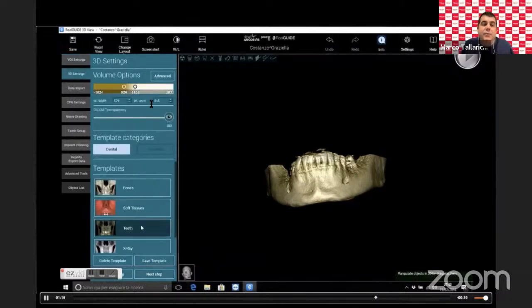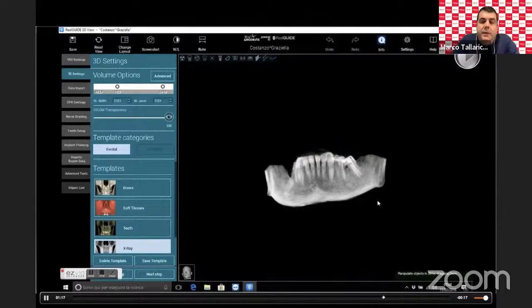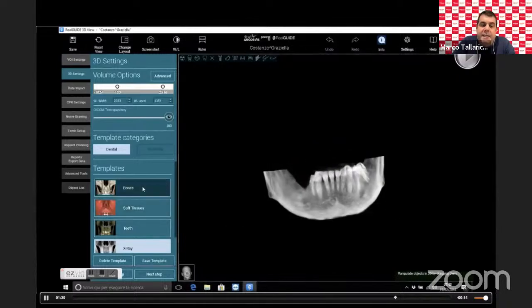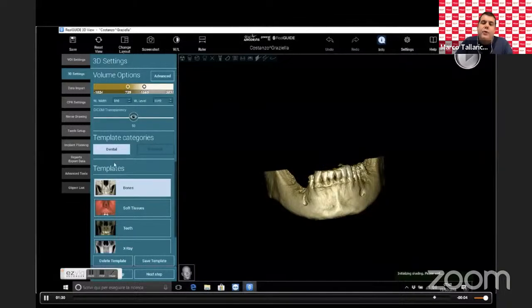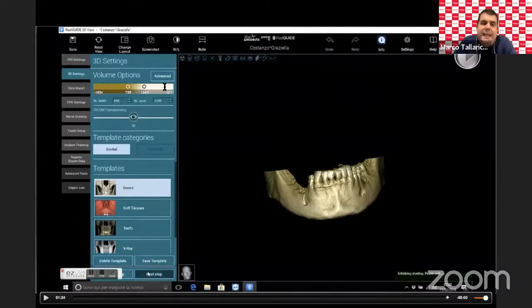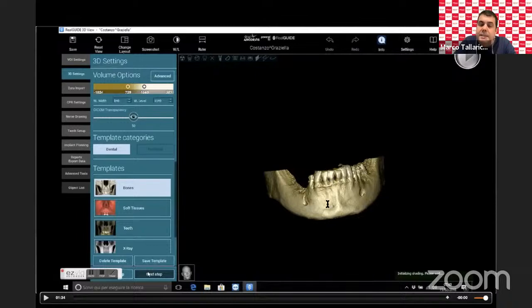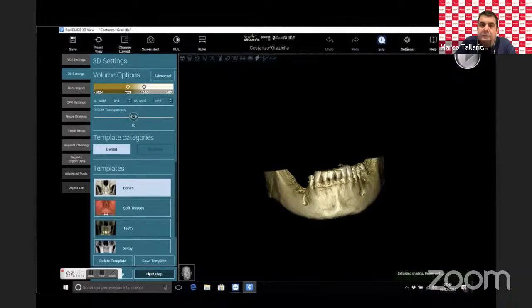The next step is to choose templates to get an X-ray view, teeth view, soft tissue view, or bone view. Usually we use the bone view and adjust the ISO value. Moving the ISO value to the right selects more radiopaque portions; to the left, soft tissues. It's very important to visualize the teeth correctly because in this protocol we use the teeth for matching.